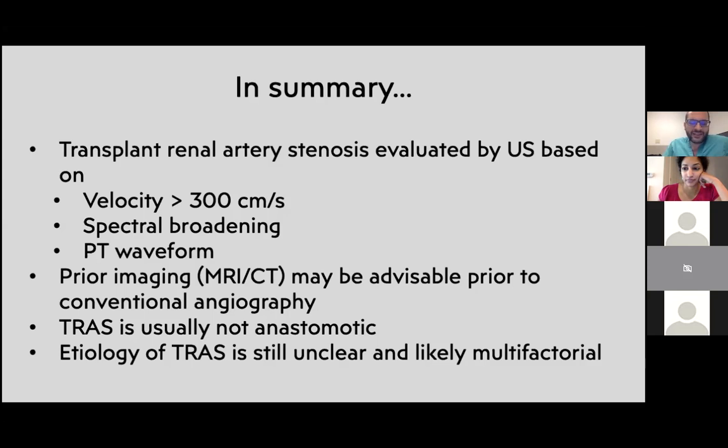I know our interventional radiologists would still want to get the MR just so that they can have that roadmap and know what they're dealing with ahead of time. Because things like that dissection flap, which is actually not uncommon, or being able to see a really long segment stenosis is useful, because not every stenosis that's visible is actually treatable.